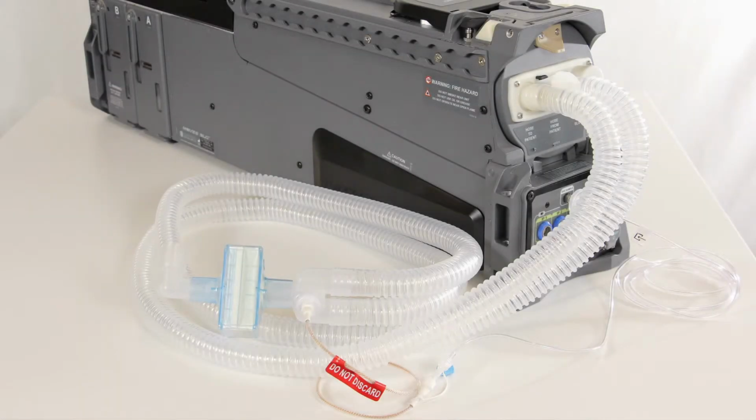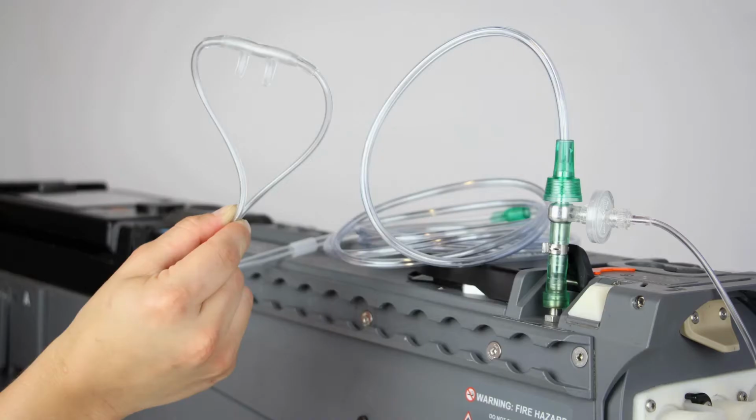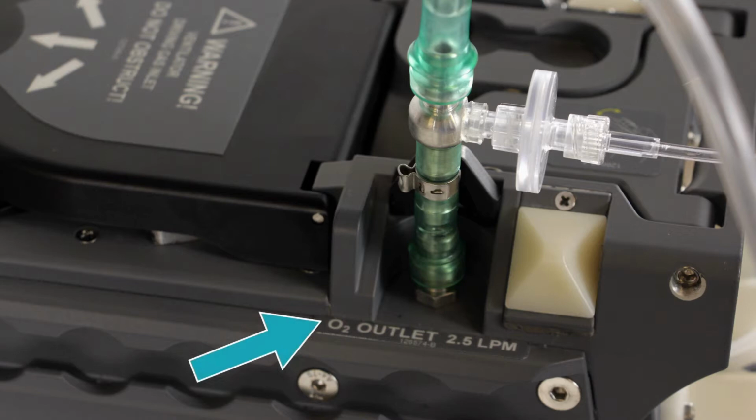An intubated patient will be connected to a ventilator breathing circuit. A patient that is not intubated may receive supplemental oxygen via a nasal cannula, in which they will be connected to the O2 outlet on the left side of the device.